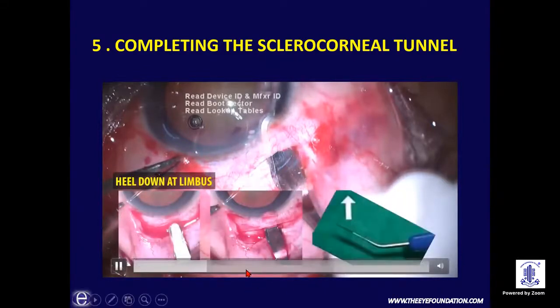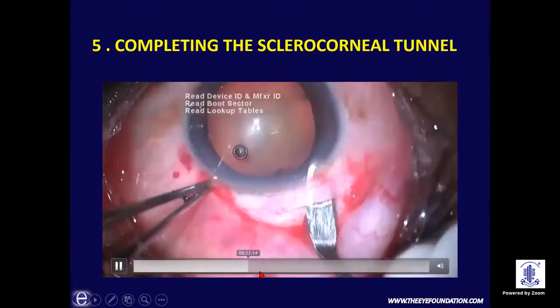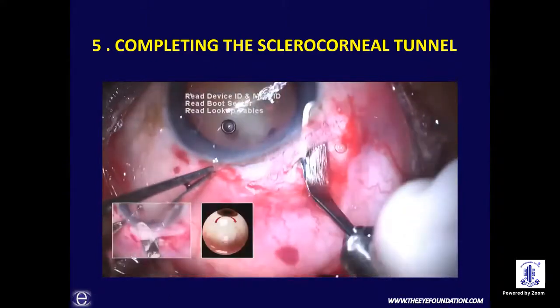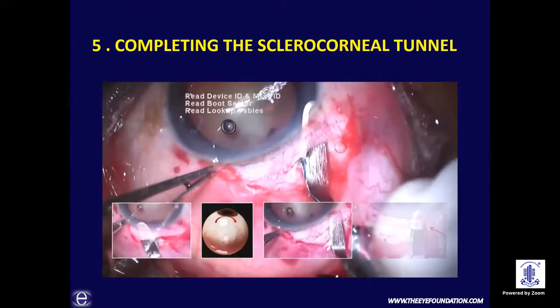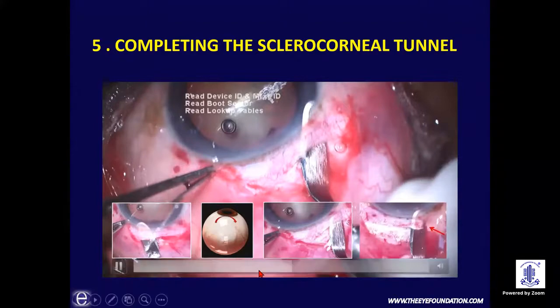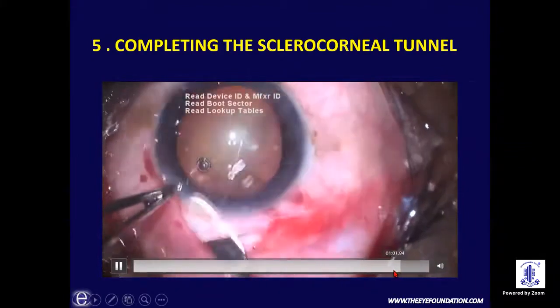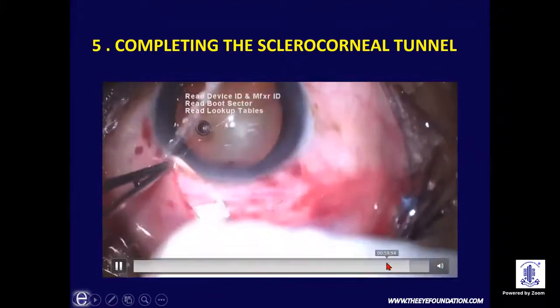And the second change in the curvature happens when we are tunneling towards the sides. So always tilt your crescent a little bit. If this is not done, if the crescent is going to be straight, as shown in the red arrow, we can have a buttonhole on the extreme sides. So take into account these two changes in curvature while doing the tunnel. And at the extreme end of the tunnel, always do a good side pocket so that it can accommodate the larger grade nucleus.